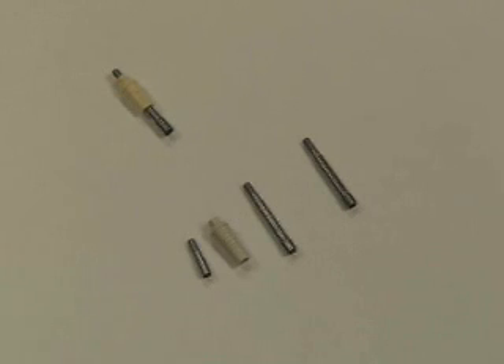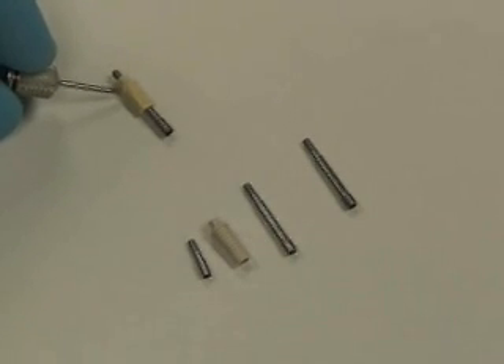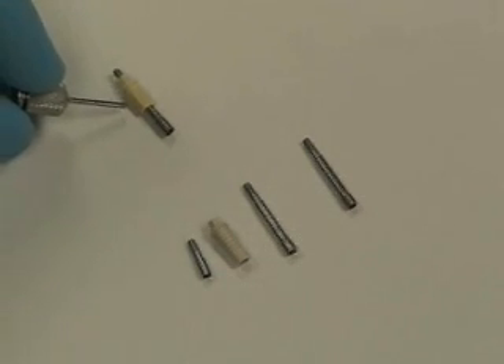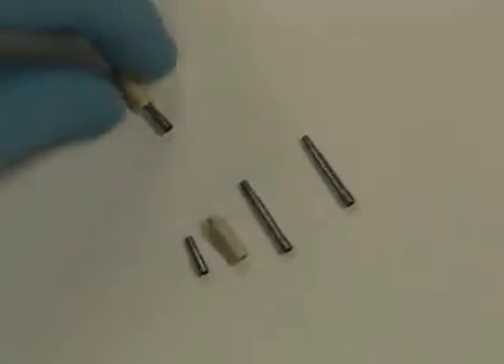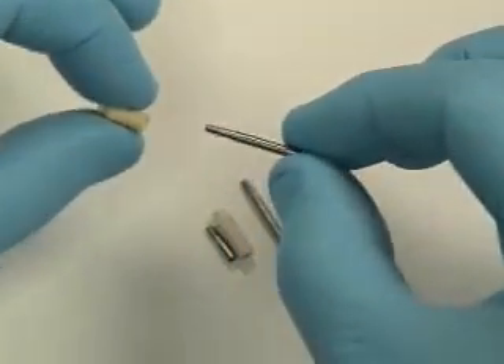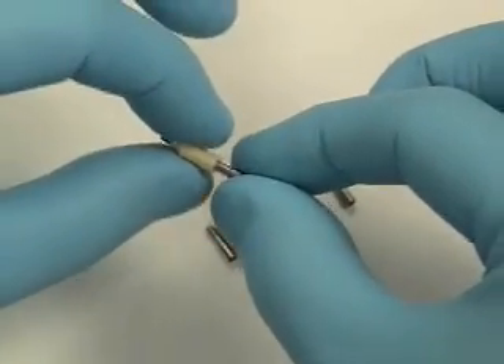I'd like to show you a little bit of a difference between some of the provisional abutments that are available. This is a Zimmer provisional abutment — it's a plastic internal hex configured abutment with a long screw. What you end up having to do is cut the screw off and use it as your coping screw.